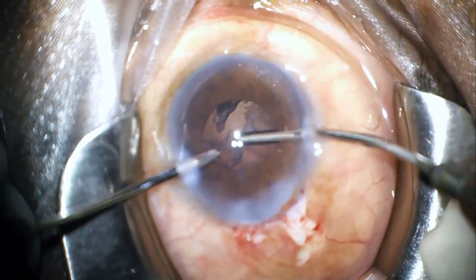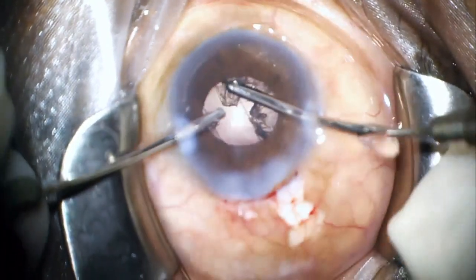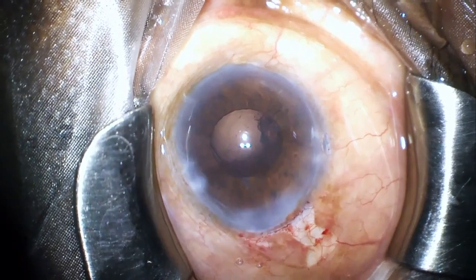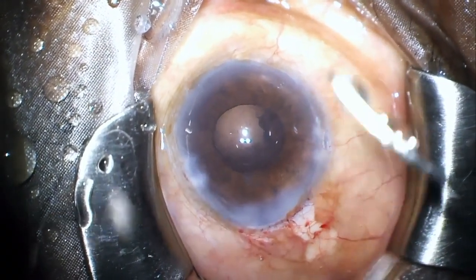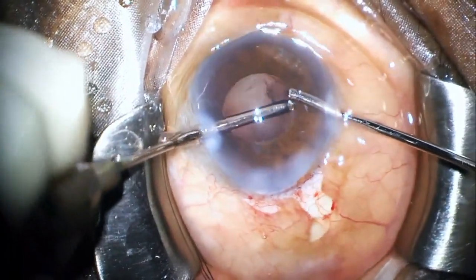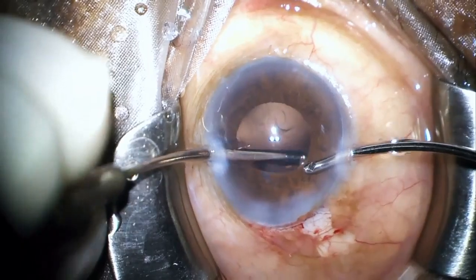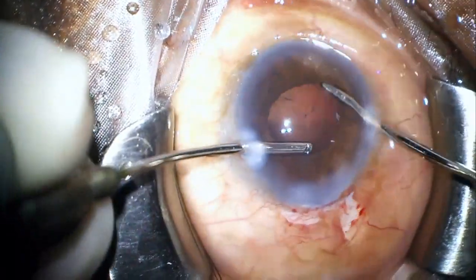So what I decided to do next was to go ahead with the aspiration of the cortical matter, hoping that once the irrigation aspiration was complete and all the fluffy cortex was removed, it may improve visibility and the chances of retrieval of the fragment. However, even after the irrigation aspiration was done, I wasn't able to find the fragment — probably all the maneuvering had actually pushed the fragment to the extreme periphery of the bag.